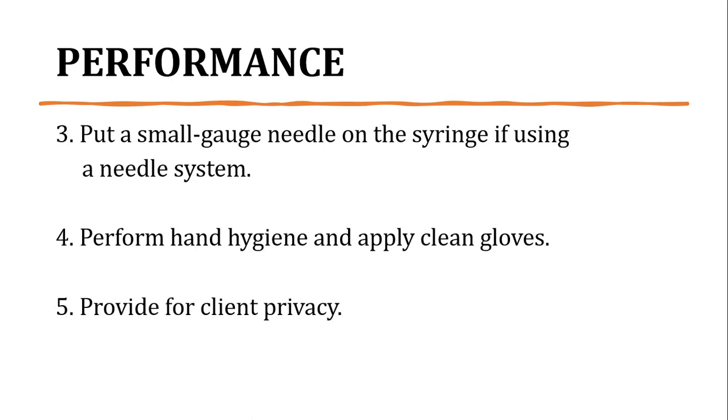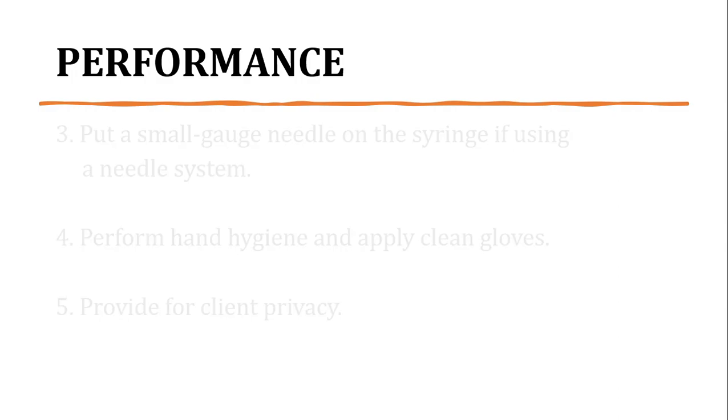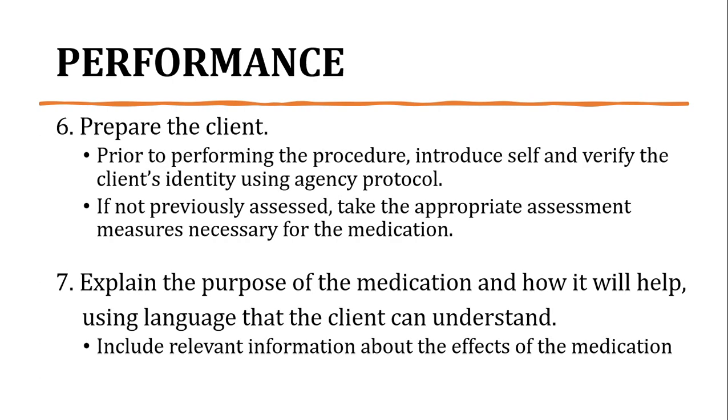Next one is to put a small gauge needle on the syringe if using a needle system. Perform hand hygiene and apply clean gloves. Provide for client privacy. Then prepare the client. Prior to performing the procedure, introduce self and verify the client's identity using agency protocol para po ma-ensure na mag-administer ng medication sa right client.